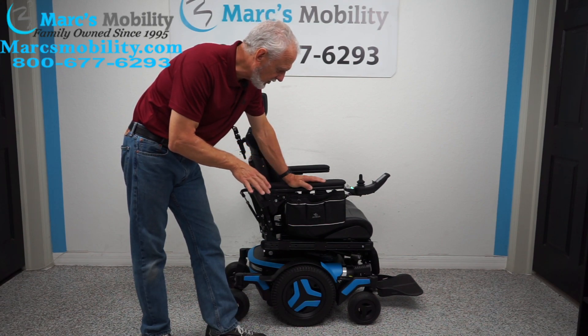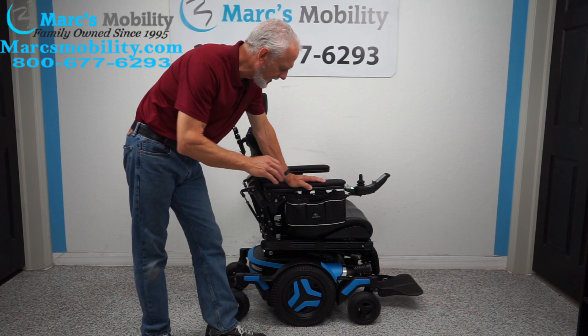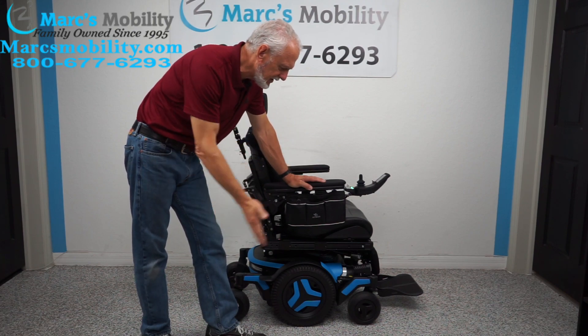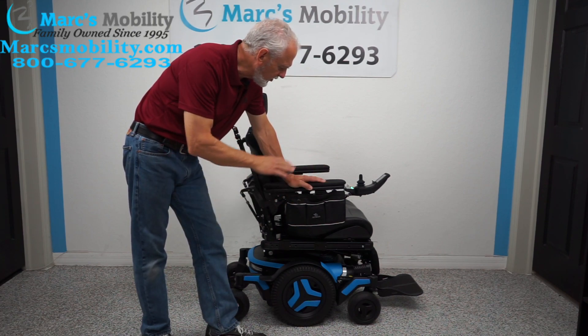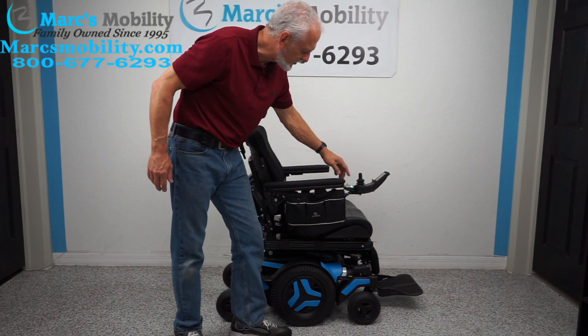This power chair is fully loaded — it has all kinds of custom features. It has the 12-inch seat lift, electric tilt, electric recline, and electric feet. All functions can be worked through the joystick, but I like to use the little quick switch box back here — it's quicker for me.